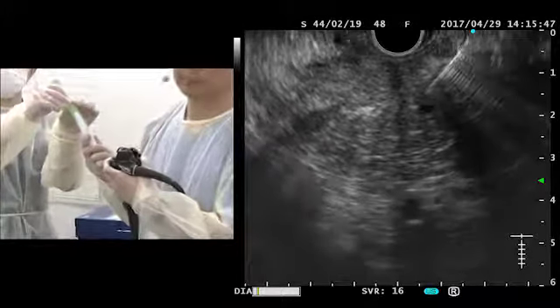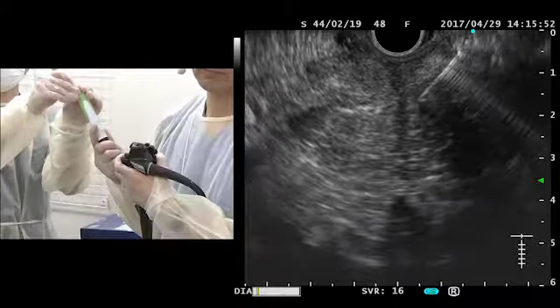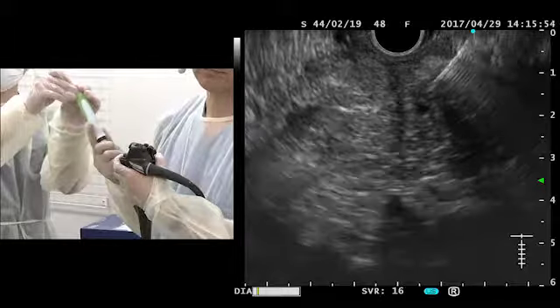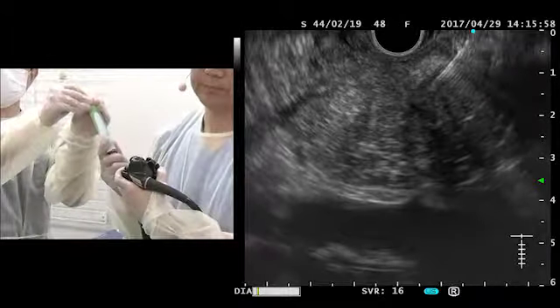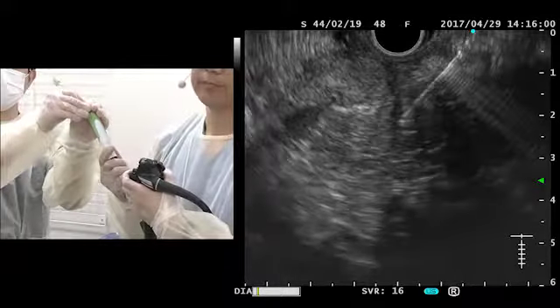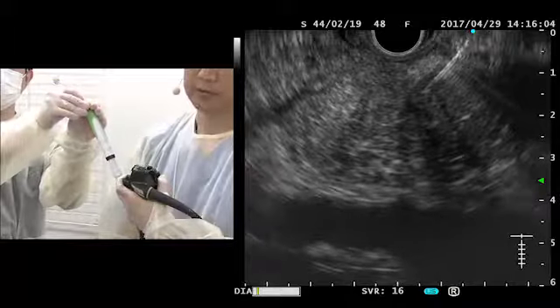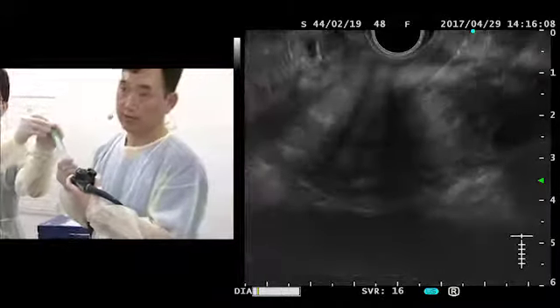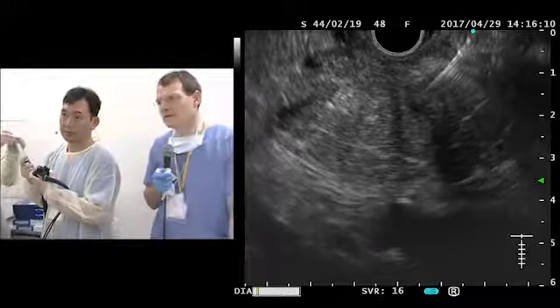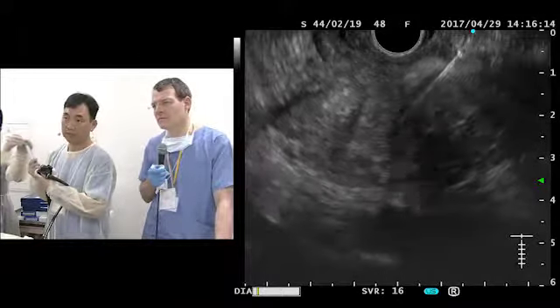Norio, what is your position? There are a lot of discussions about which needle to use, etc. Here in this case, we discussed that we also need to exclude autoimmune pancreatitis. What about your position on the 25 gauge needle in the pancreas? Yeah, so 25 will give you a very small material. It's adequate for cellular evaluation. So I rather use the 25 for a difficult location. It's a much more fibrous tissue.